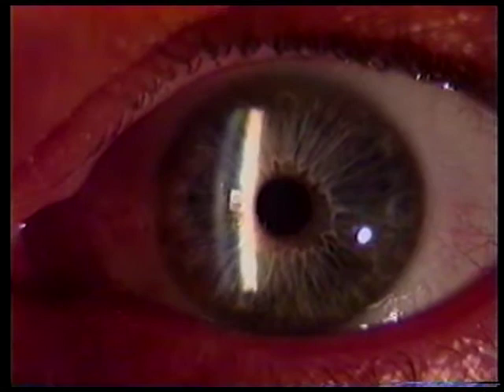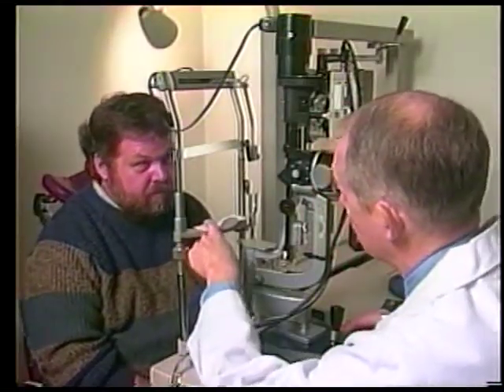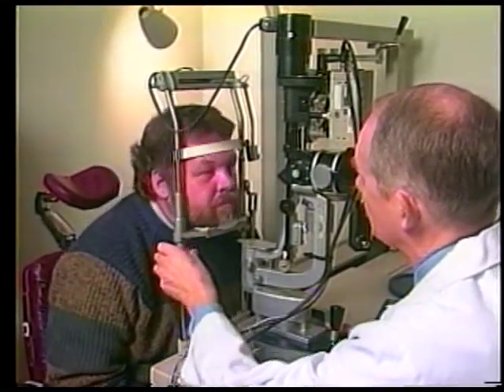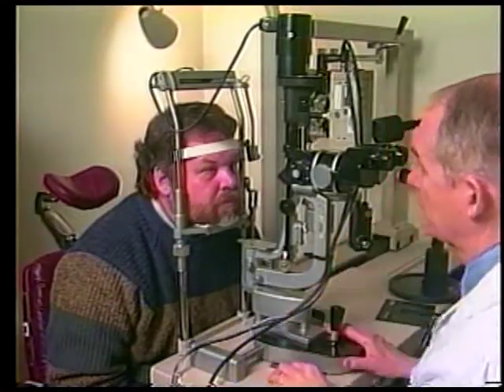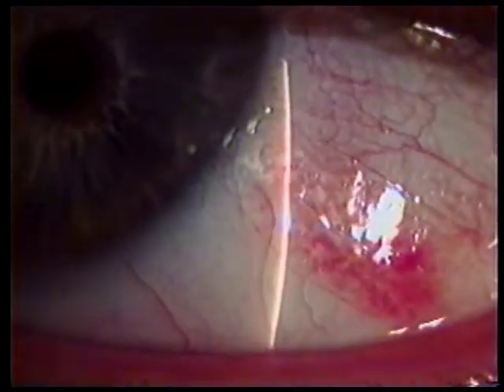Now that you know how to focus the slit beam on the eye, you need to engage the cooperation of your patient. The patient must fixate or look at some convenient target to keep their eye steady. Your ear makes a good target. This is essential when you must study a particular structure in detail. Start your examination with low power magnification so you don't miss the forest for the trees. Higher magnification can be used when there is a particular area of interest requiring further study.